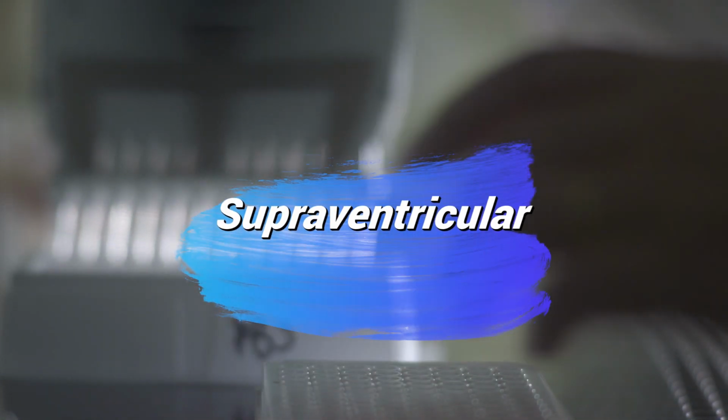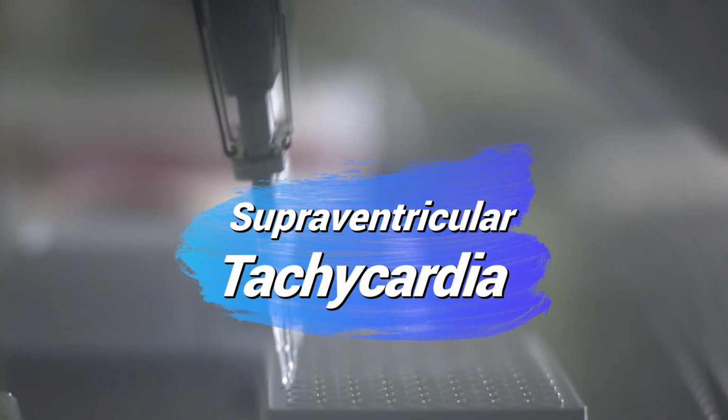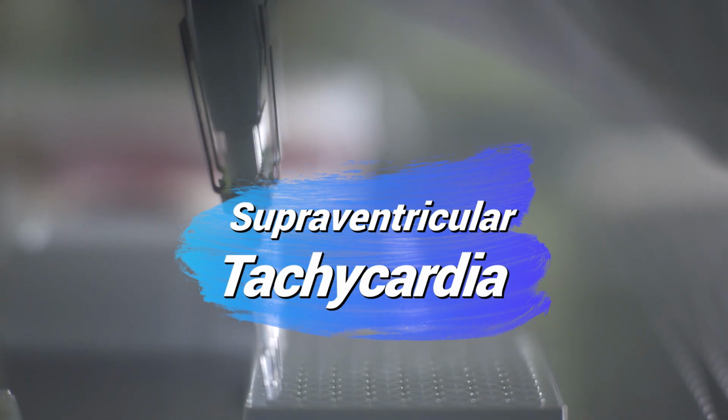Welcome back. In this video, I'll teach you everything that you need to know about supraventricular tachycardia. I'll teach you how to read the ECG, how to know the symptoms, and how to treat the patients.